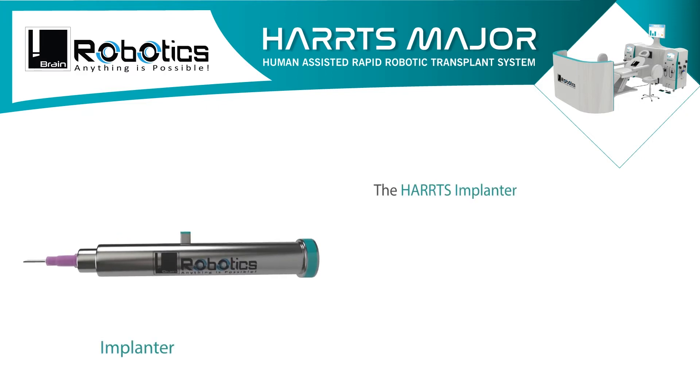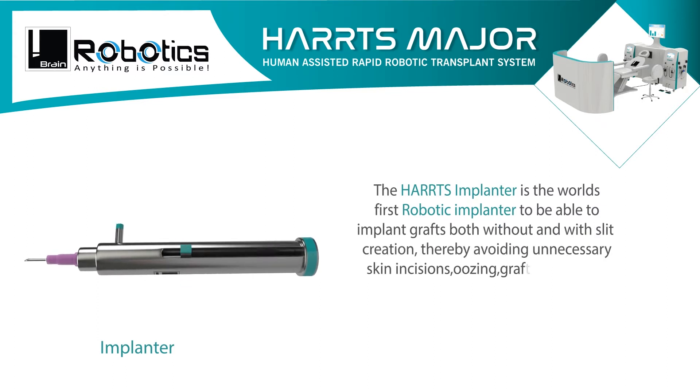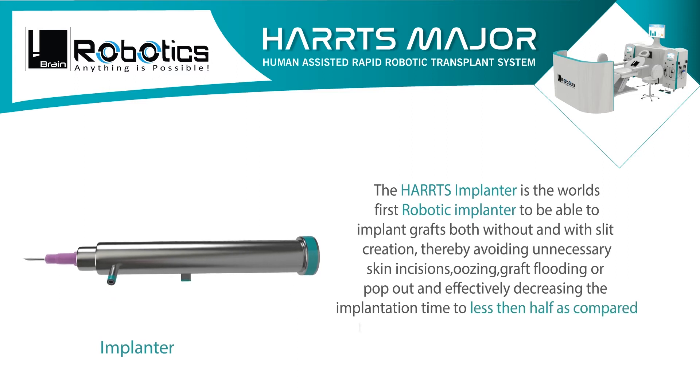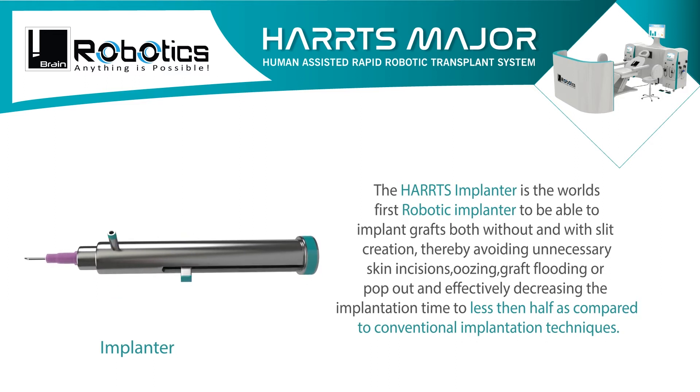The HARRTS implanter is the world's first robotic implanter able to implant grafts both without and with slit creation, thereby avoiding unnecessary skin incisions, oozing, graft flooding, or pop out, and effectively decreasing the implantation time to less than half compared to conventional implantation techniques.